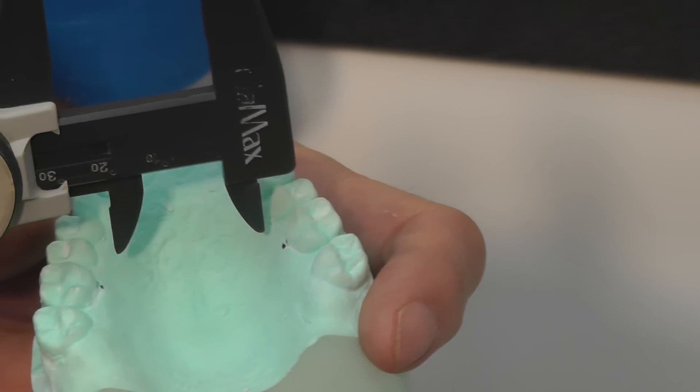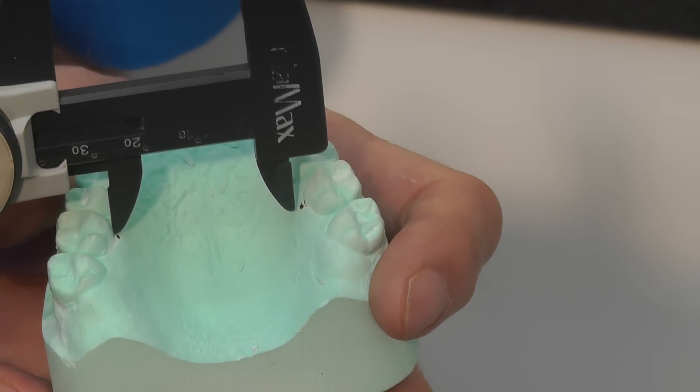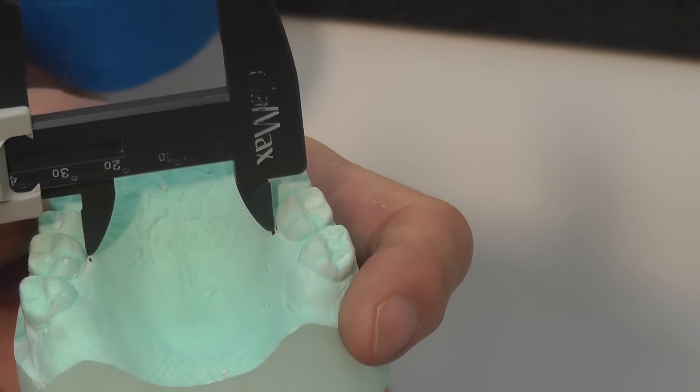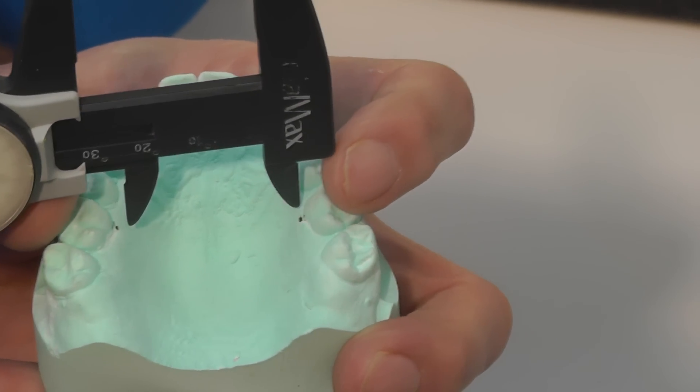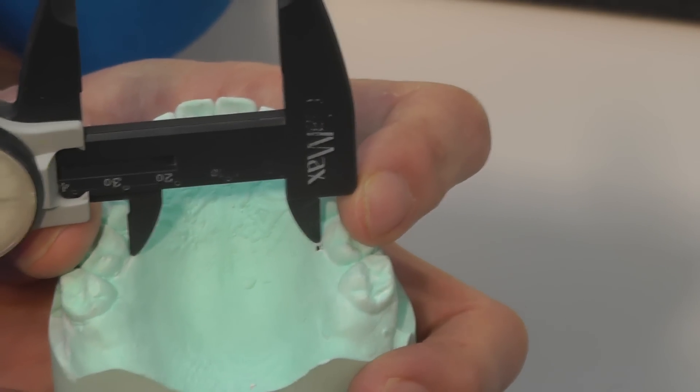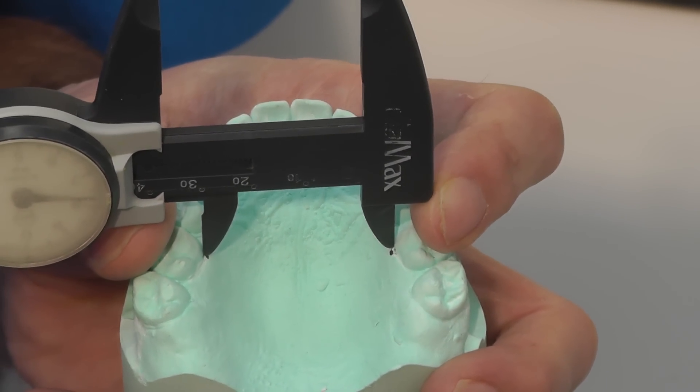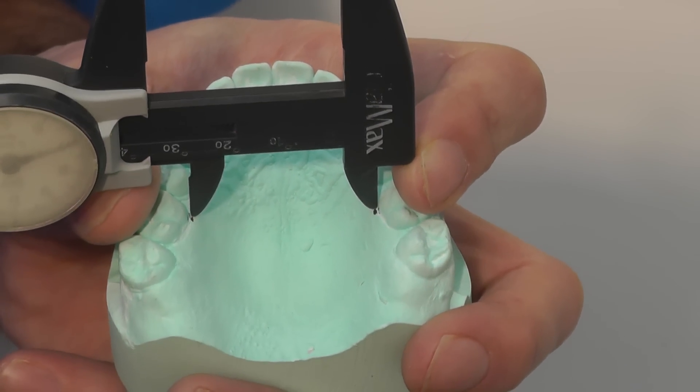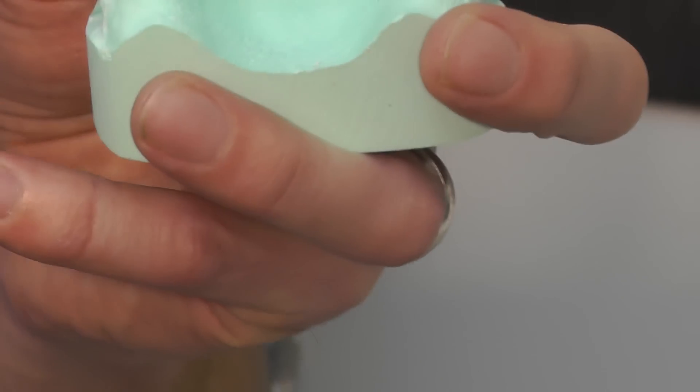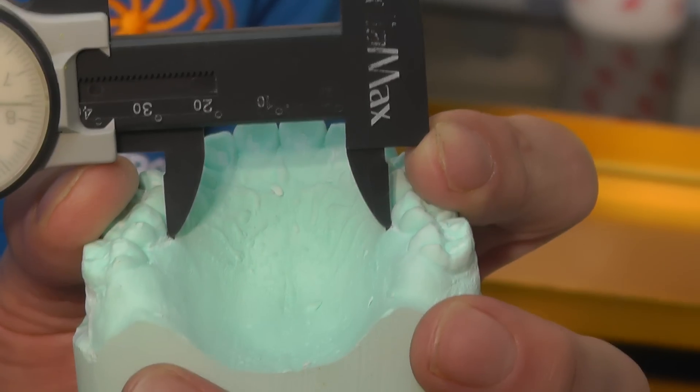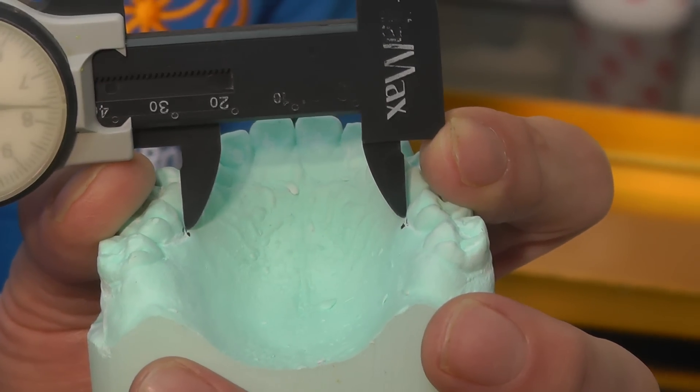Using a dial caliper, I'll measure from one side to the other. If you hold your fingers, you can make a swing action, swinging backwards and forwards between these two points. As you can see, you're getting just down in there.